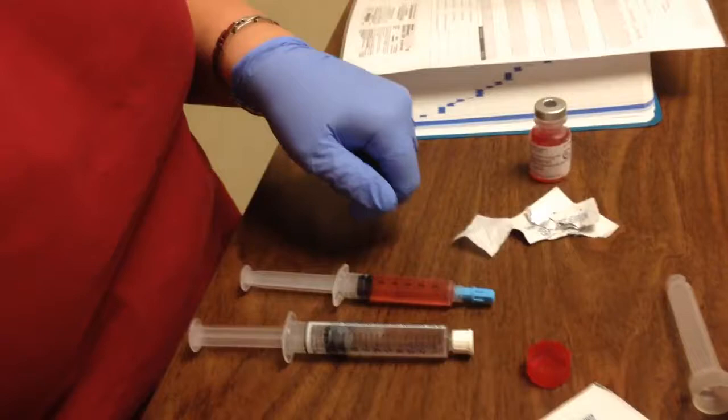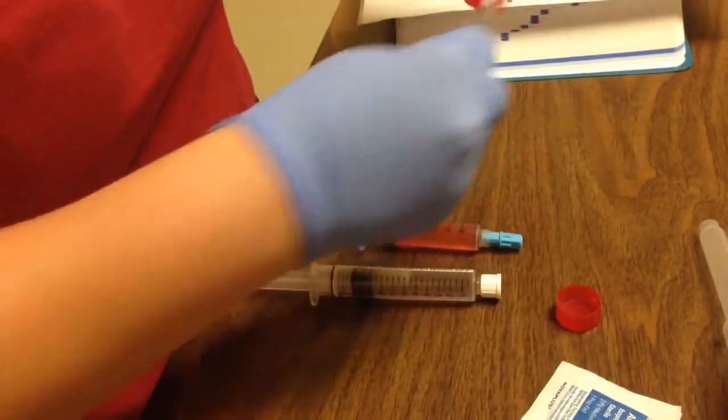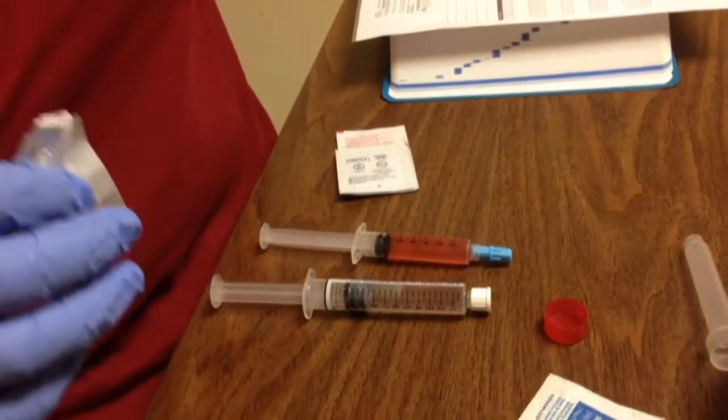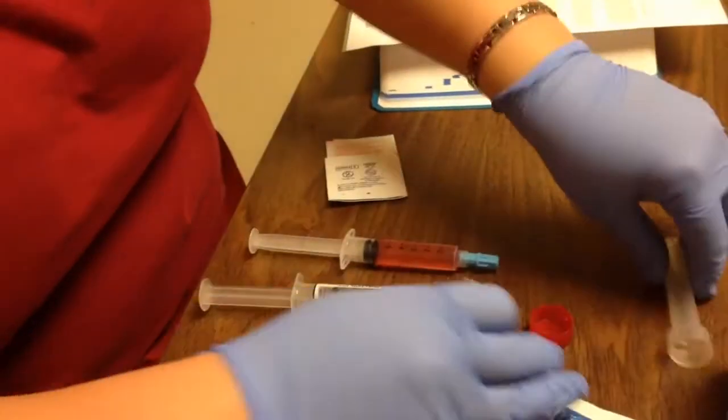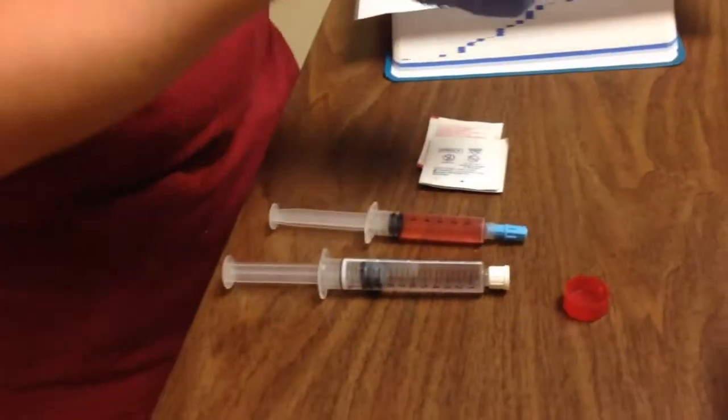Okay. I'm going to take a saline flush with me. I'm going to take alcohol preps. We would dispose of this along with the syringe. Again, if it's a narcotic, make sure somebody watches you waste it. I'm going to go ahead and take my gloves off. Dispose of all this. Okay, now I'm ready to go into my client's room.